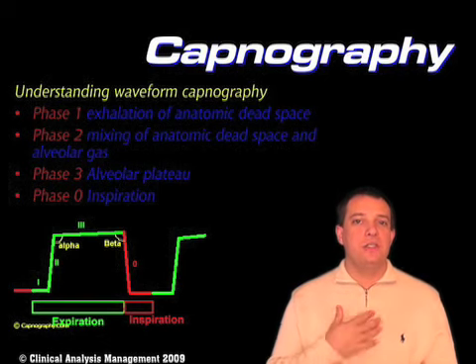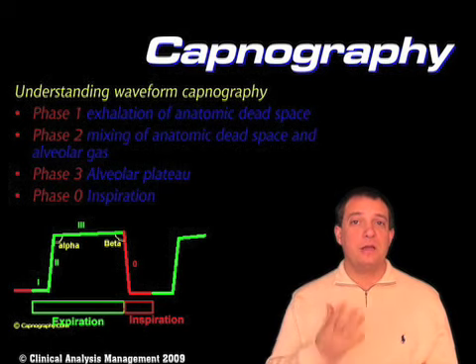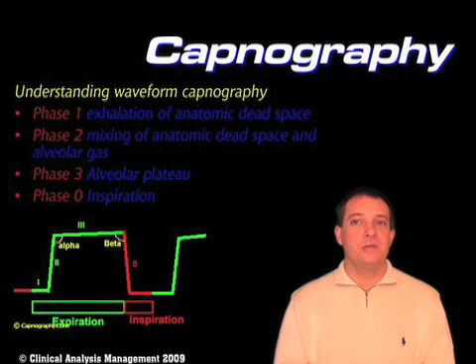I would argue that every single patient that's intubated needs continuous waveform capnography, and most patients with respiratory failure, even if they're not intubated, or respiratory distress and not intubated, should also be on non-invasive capnography by nasal cannula or something like that. It is a tremendous tool. It's just understanding what its limitations are. So let's talk about capnography itself. Let's talk about the actual capnogram for just a few minutes.